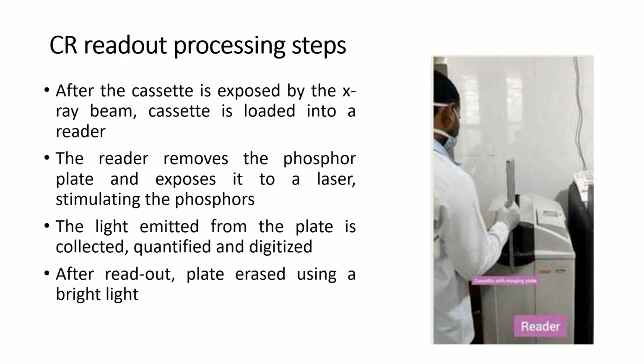After discussing the principle of the CR system, we will discuss the CR readout processing steps.